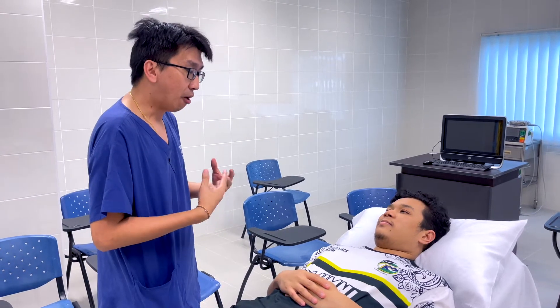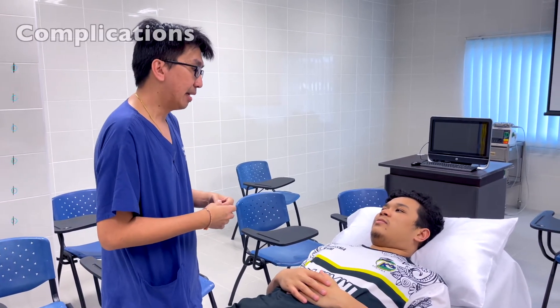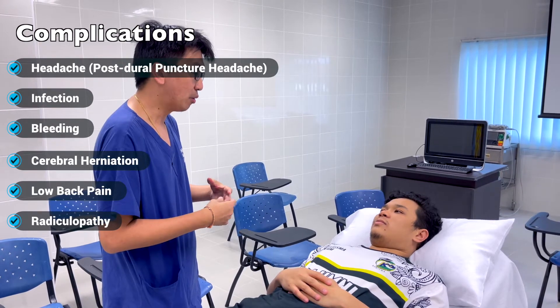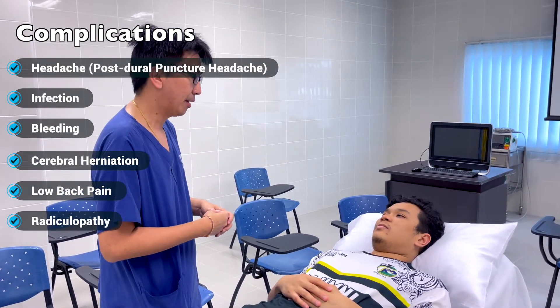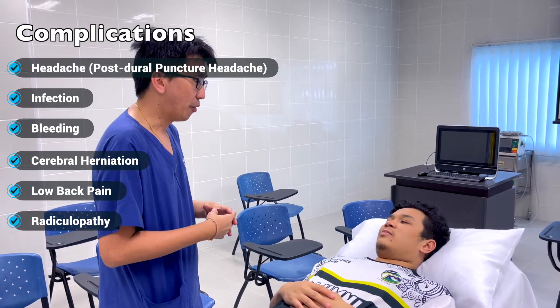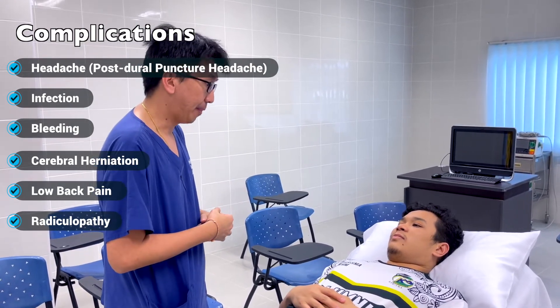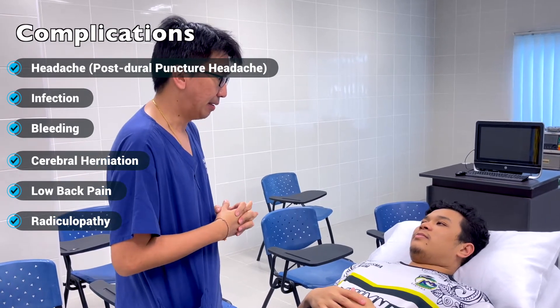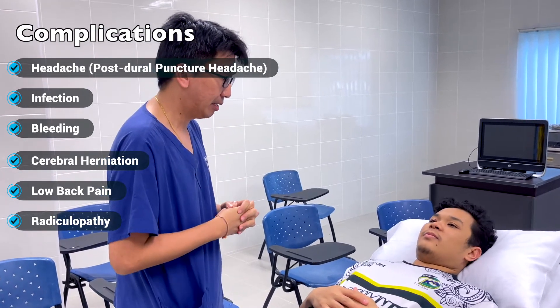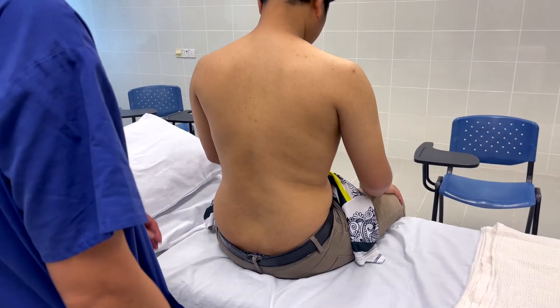The complications include minimal bleeding tendencies and you will have some minimal headache after the procedure, which will resolve after a few hours upon lying flat. Do you understand? Yes. Do you have any questions about this procedure? No. Alright, thank you Mr. Najib.